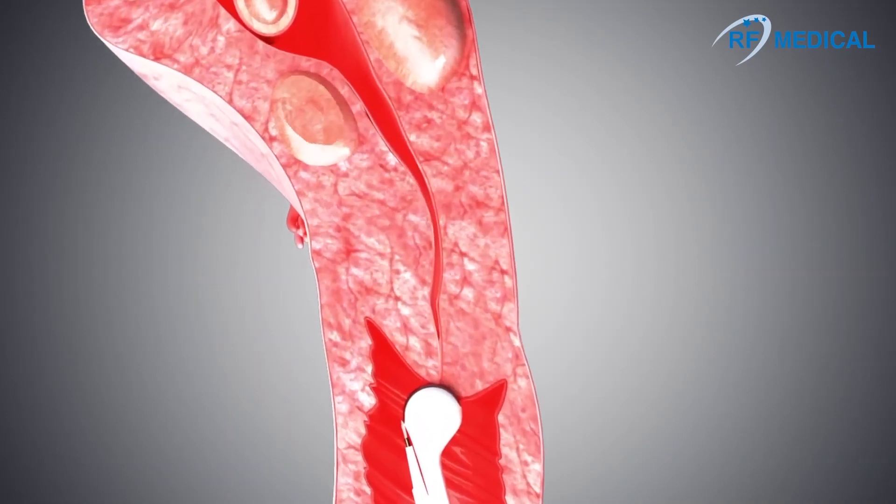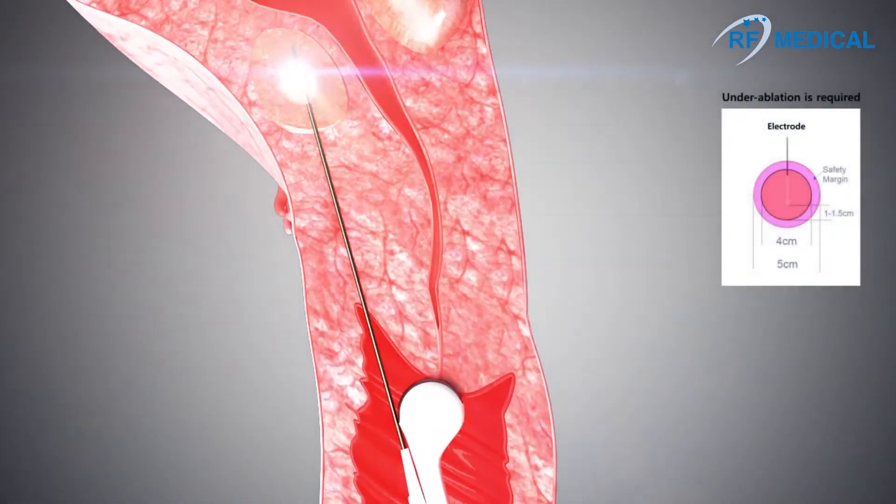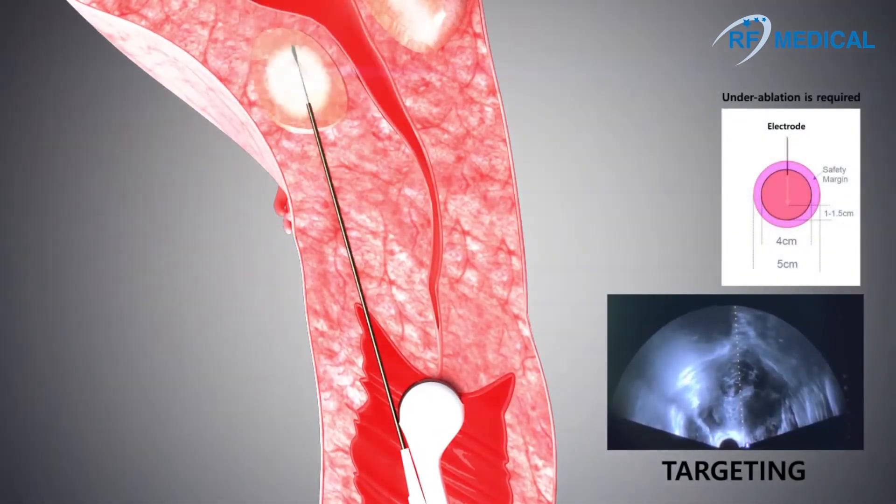After confirming the position of the myoma with the use of ultrasound, insert the electrode in the myoma and position the active tip in the center.